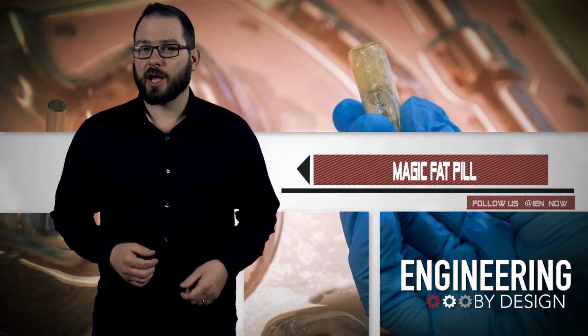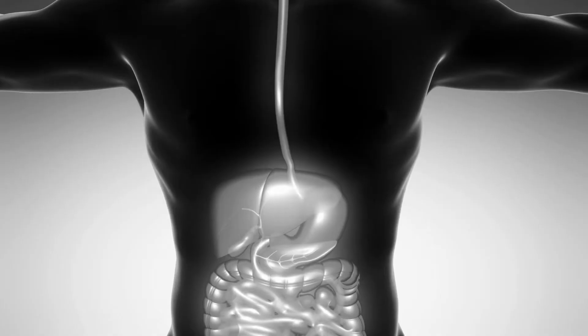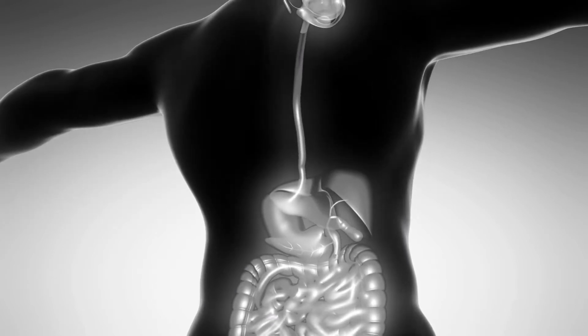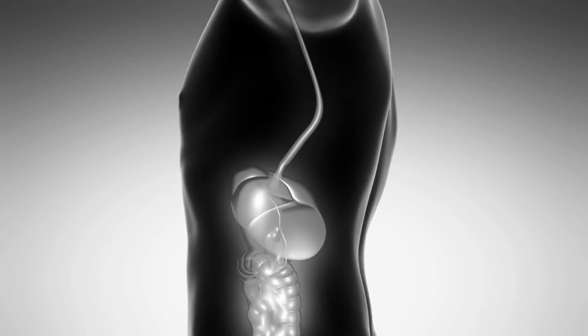Last year, the team did a trial with a healthy patient volunteer, however the capsule was inserted with an endoscope. The balloon was successfully inflated within her stomach, and she didn't experience any discomfort or injury from the inflation. Right now, it is quite a horse pill to swallow, measuring about 3 centimeters by 1 centimeter.